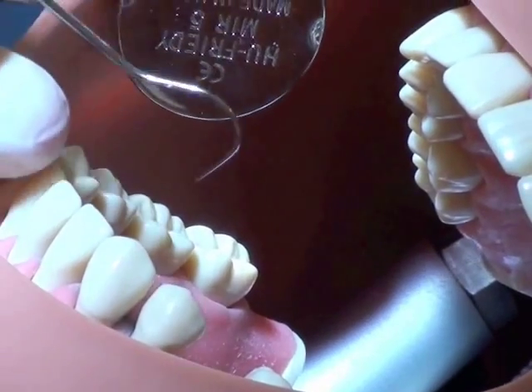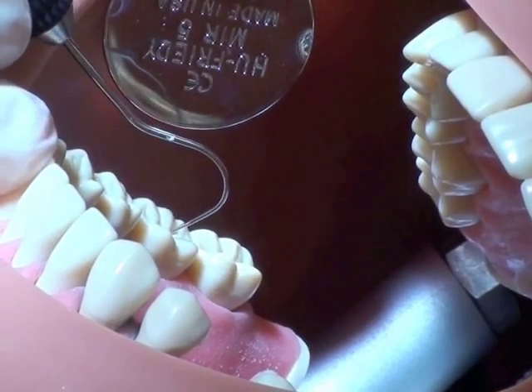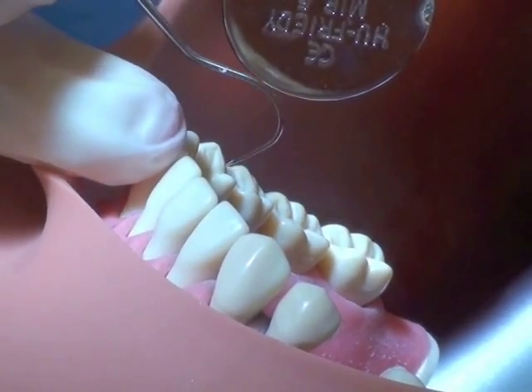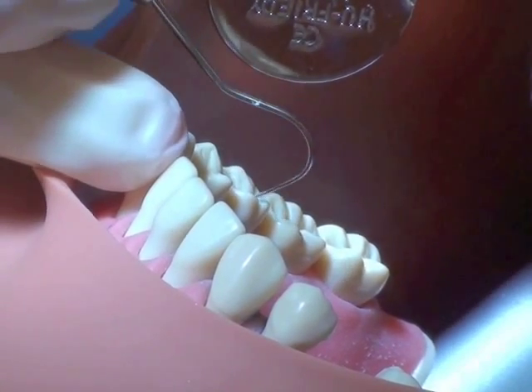If there are any existing restorations, now's the time to trace those margins to be sure that there are no discrepancies. Other than that, you're going to be using a lot of visual examination of the teeth.